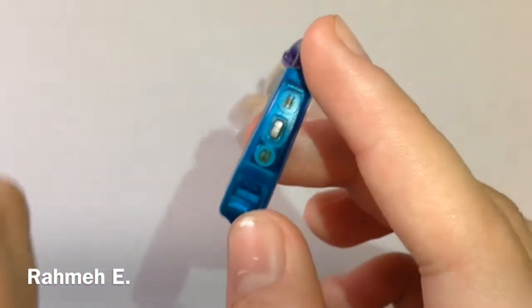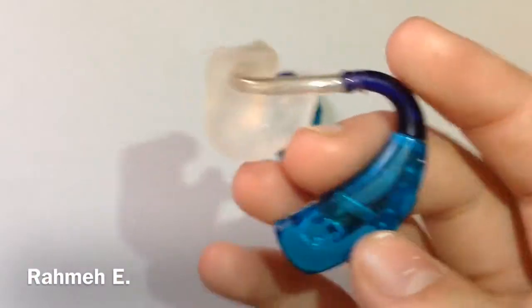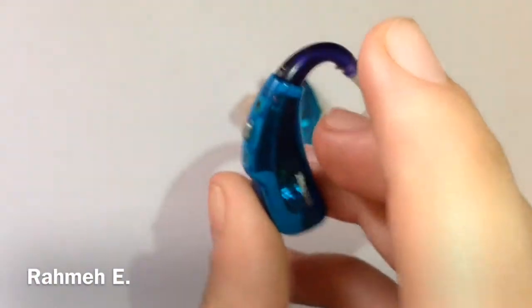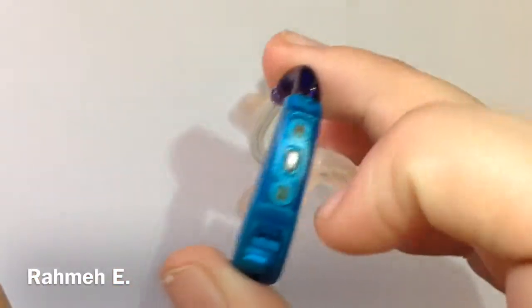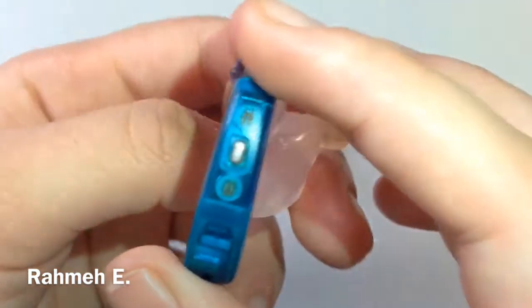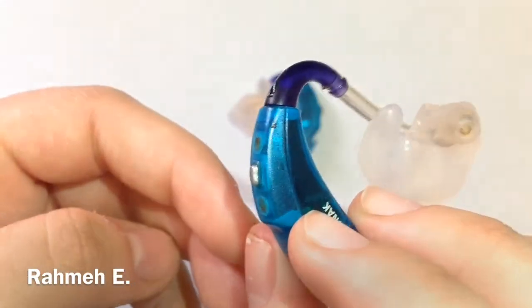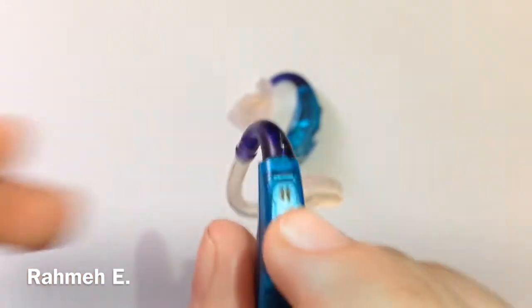Now to the hearing aid itself. The light blue part is the hearing aid. The first thing you see is the button. That button is not an on/off switch — it's for changing programs if the hearing aid has more than one. But since this hearing aid only has one program, this button doesn't really do anything.